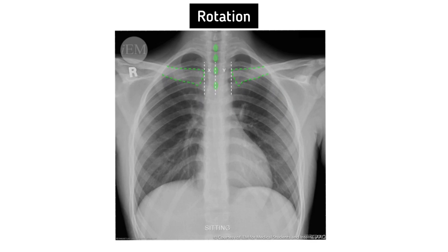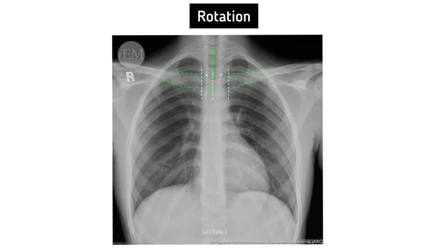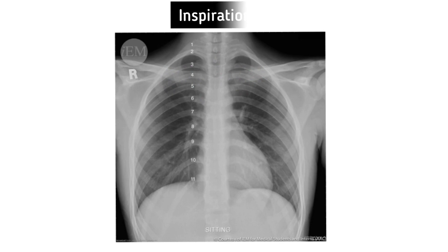For rotation, the clavicles should appear symmetrical and be seen as equal length. The distance between the thoracic spinous process and the clavicular heads should be equal. If there is rotation, the mediastinum may look abnormal. Here, the x-ray shows minimal rotation — compare X and Y.